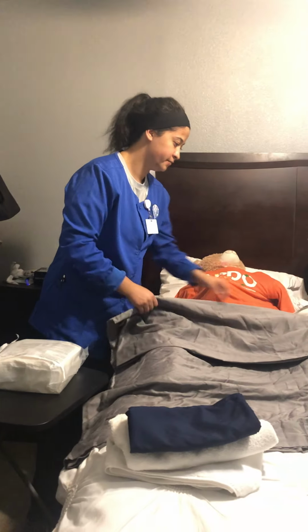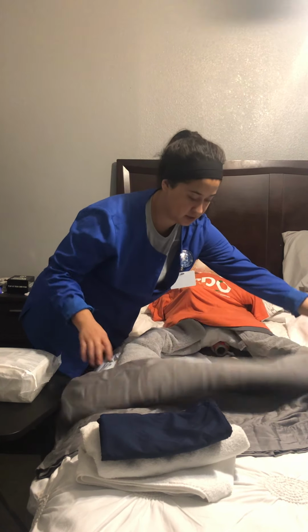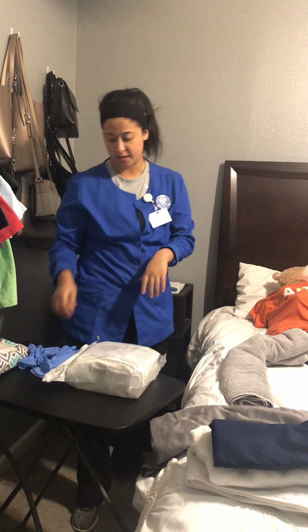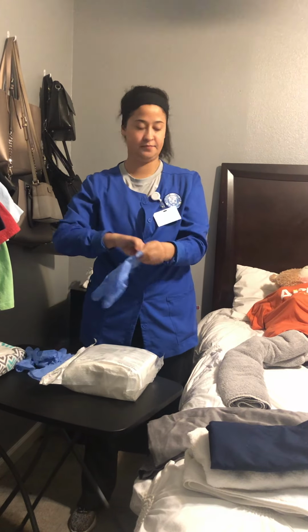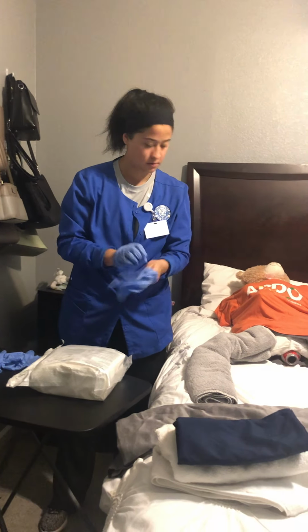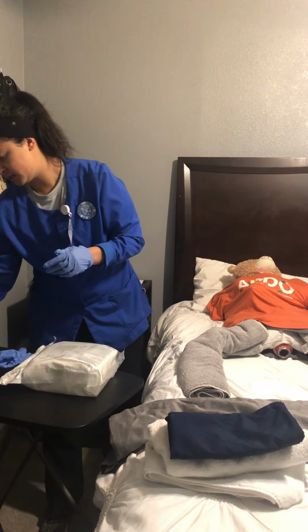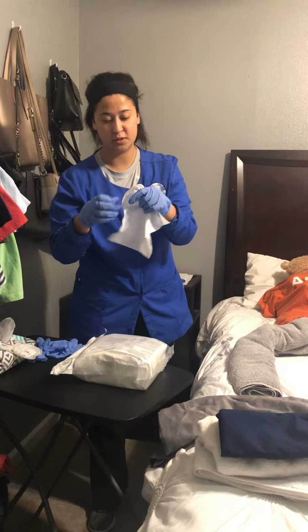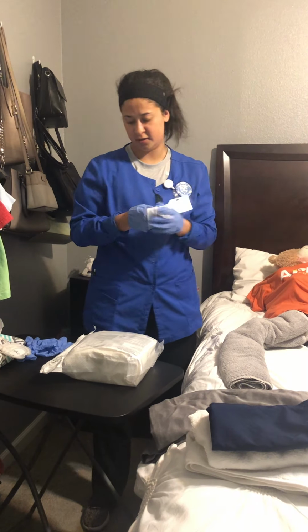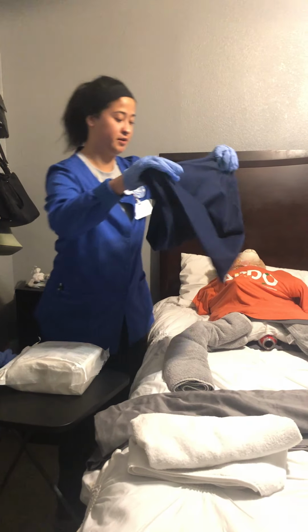I would then perform hand hygiene because I'm going to clean my patient. Let me remove this real quick. So I would hand hygiene again. I'm going to place some gloves on. I'm going to get a wipe or a towel with soap and water. Oh, before I do that, let me put an absorption pad under my patient.